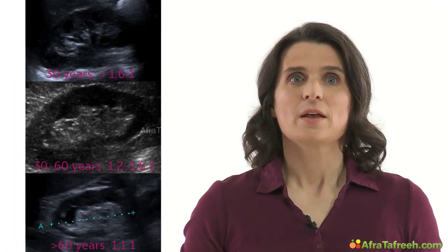In degenerative changes of the kidney, the renal parenchyma gets smaller and gets atrophic, whereas the renal pelvis won't. So the relationship between parenchyma and pelvis shows the degree of atrophic changes. The parenchyma Pyelon index changes physiologically with age.